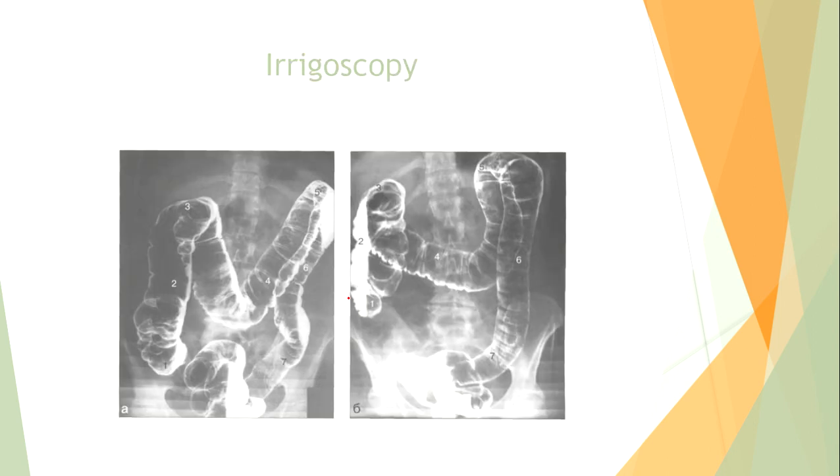Irrigoscopy. Here on the picture you can see barium, and you can see this bubble with air.